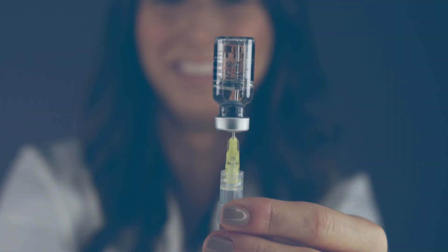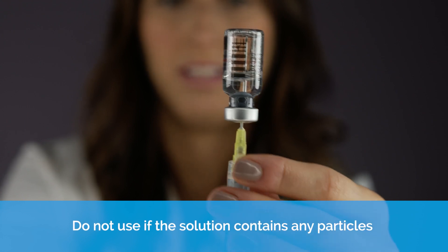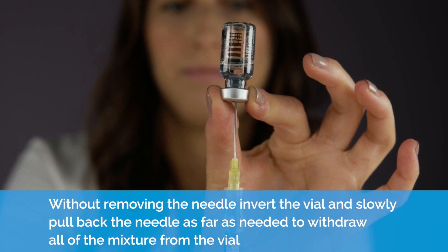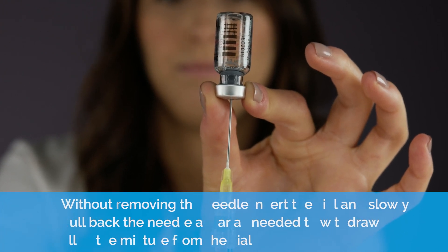Preparing the injection. Do not use if the solution contains any particles. Without removing the needle, invert the vial and slowly pull back the needle as far as needed to withdraw all of the mixture from the vial.